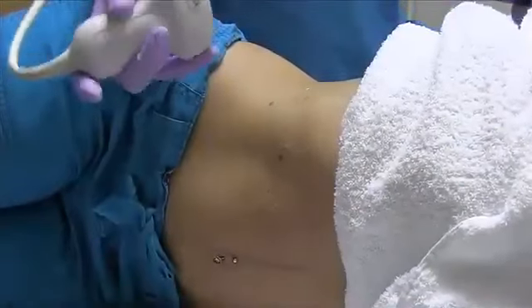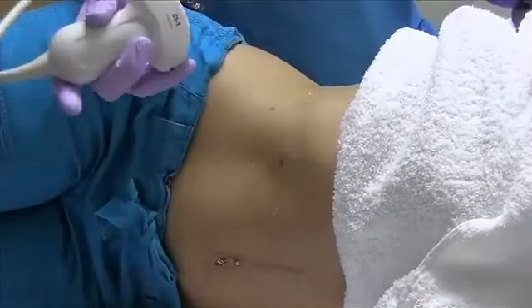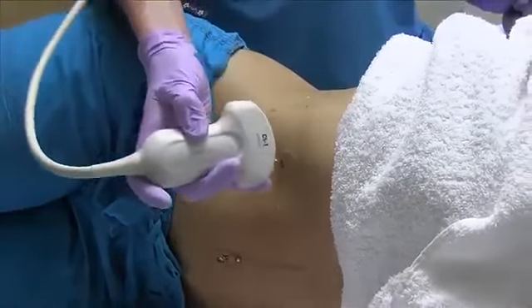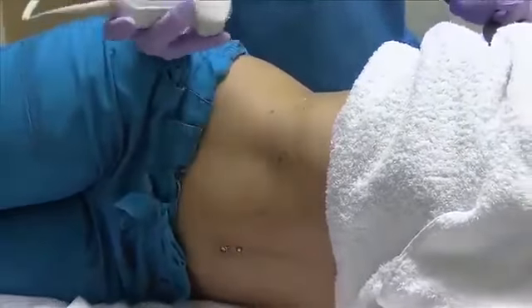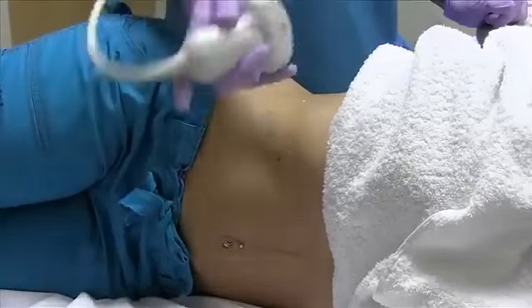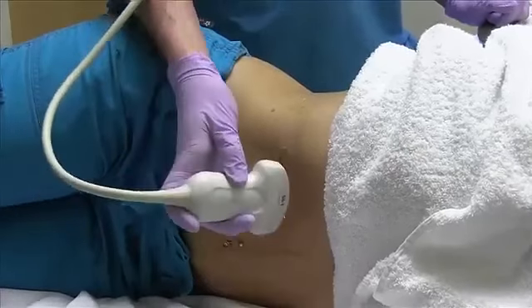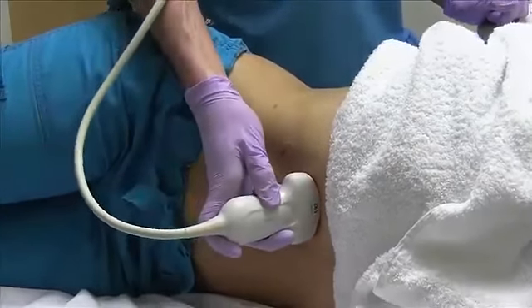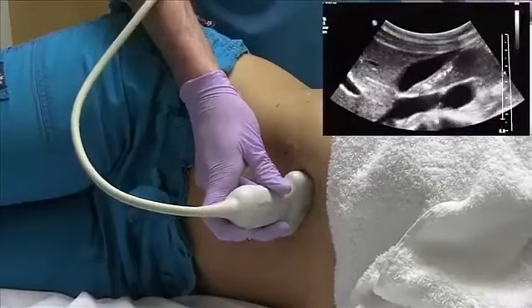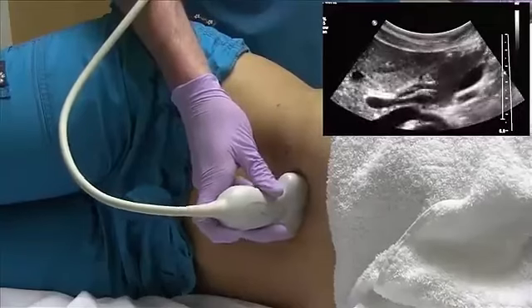After you get your supine pictures of the gallbladder, you want to make sure you decubitus the patient just to make sure there are no stones stuck in the neck of the gallbladder. You have the patient turn on their left side away from you, and that usually brings the gallbladder forward here. So we're going to come subcostal and sweep through, and you should see the gallbladder very anterior here.